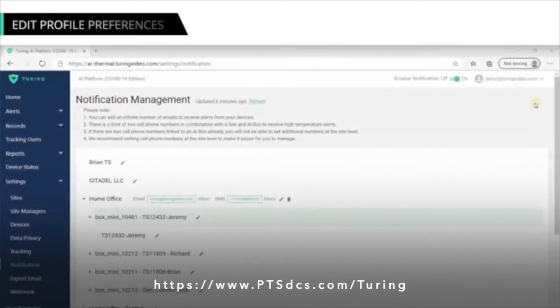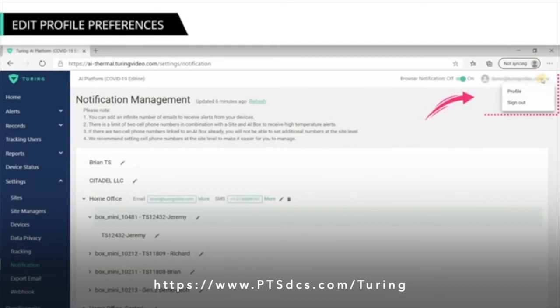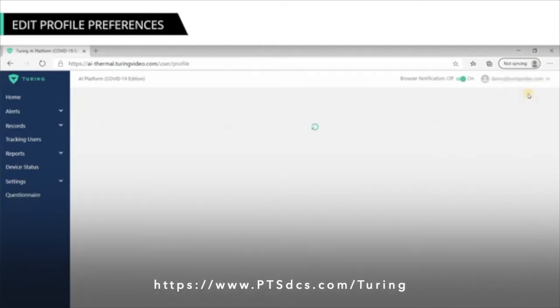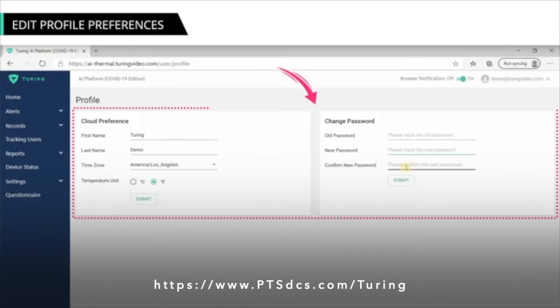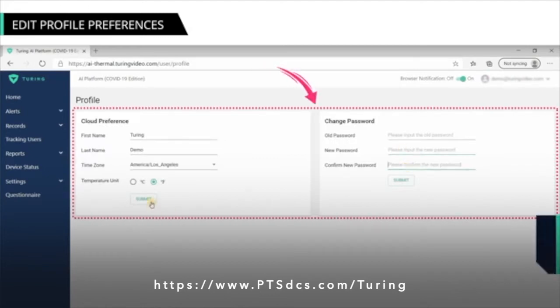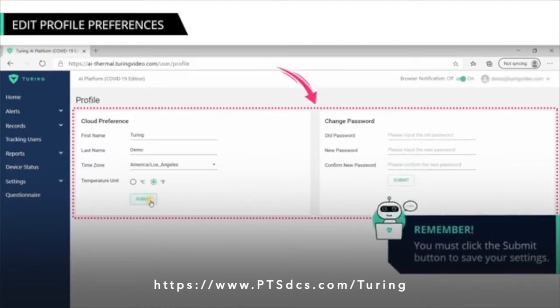You can edit your profile by clicking your username at the top right of the screen and then selecting Profile from the drop-down. Here you can change the cloud preference and password for your profile.